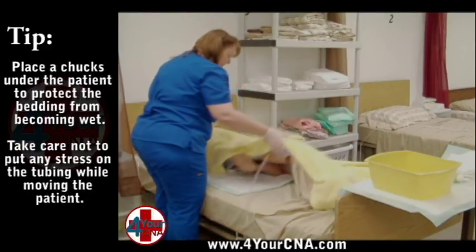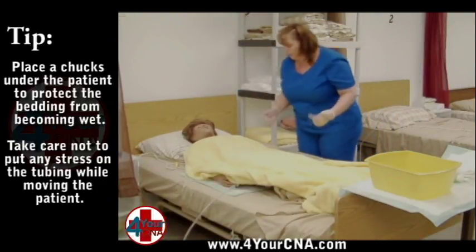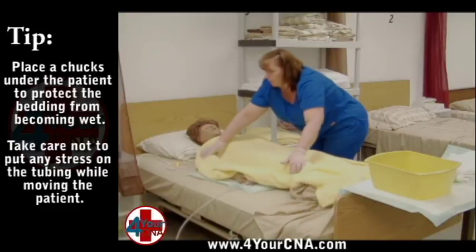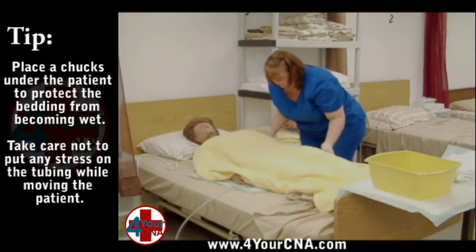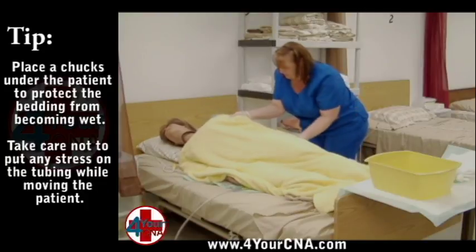Roll the patient on her side and unroll the clean chucks onto the mattress and tuck the rolled edge under the patient's hip. Move to the other side of the bed. Scoot the patient toward you. Assist the patient to tilt up on her side and smooth the clean chucks toward you. Return the patient to her back.